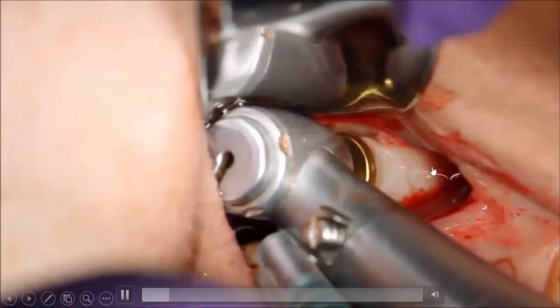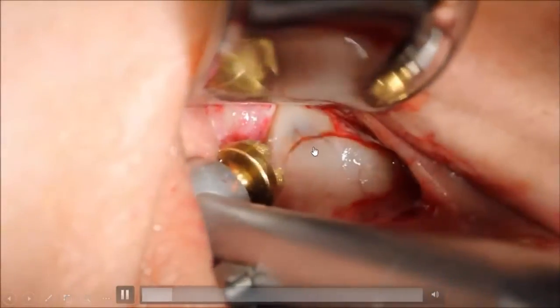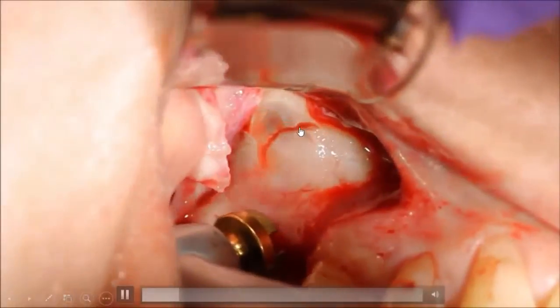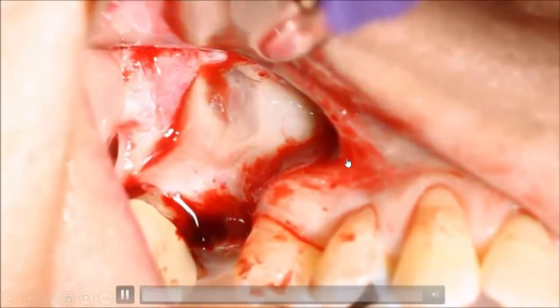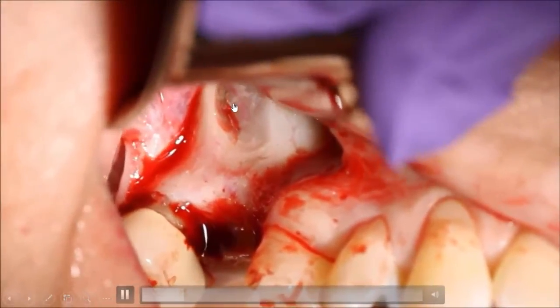As we can see, it's a large diamond bur. We call it a disc bur. It's a very common system. As we can see, a 45 degree stroke. Here we started to see the blood vessels on the sinus membrane. Little by little, I'm starting to see the blood supply as we thin out the lateral wall. Here the membrane started to be exposed more. We can see the membrane now.